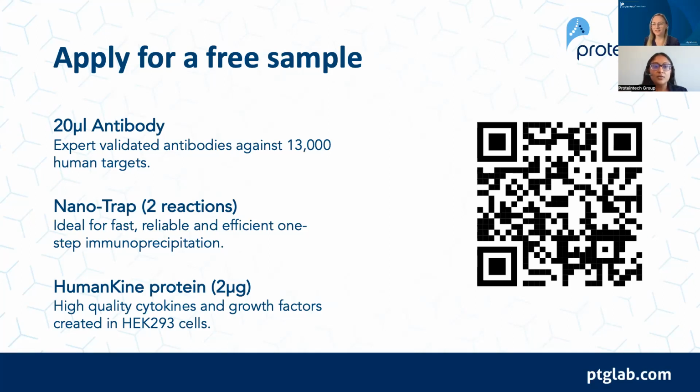So it definitely depends on the protein. Larger proteins, like Rebecca said, do have more risk of epitope masking just because they are so big. So I guess more can go wrong, and they can change shape. Also phosphorylated proteins or other proteins that have post-translational modifications tend to be more susceptible in terms of epitope masking. But it's all dependent on the localization of your protein and what your protein is.